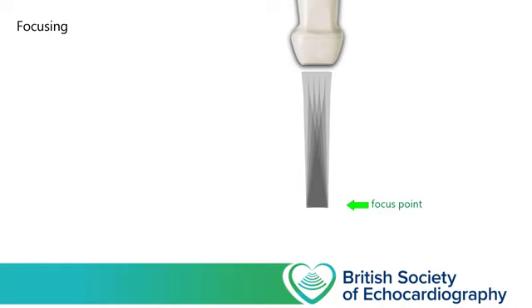What happens if we use our acoustic lens to bring those ultrasound beams in even further? Well, then we get the area of maximum overlap happening closer and closer to the ultrasound probe. Our focus point moves closer to the transducer as we angle our ultrasound beams towards the centre to an ever greater amount.